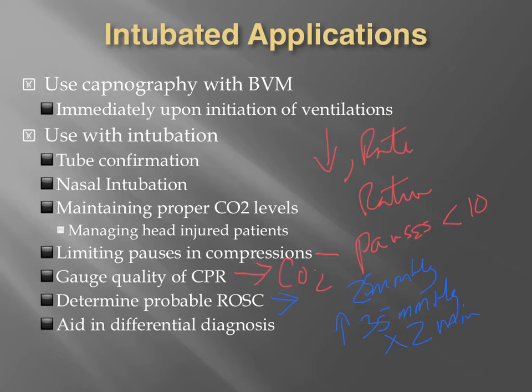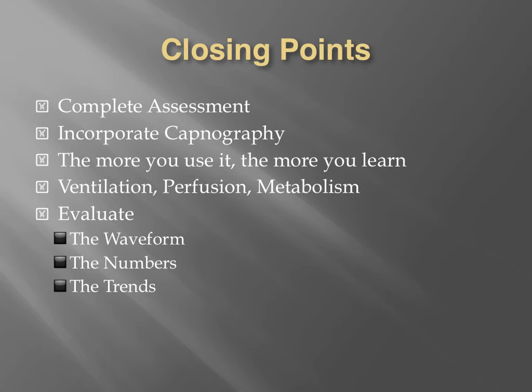And then I just kind of delved into it a little bit, and we're going to get into a huge amount of differential diagnosis in the near future with additional presentations. But especially when we have intubated applications involved and we can control things such as ventilations and possibly perfusion with CPR, we can really aid our differential diagnosis abilities and help us come to better conclusions as to what's wrong with the patient. Okay, we can talk a heck of a lot about that, but we're not going to do that today. So once again, our closing points.